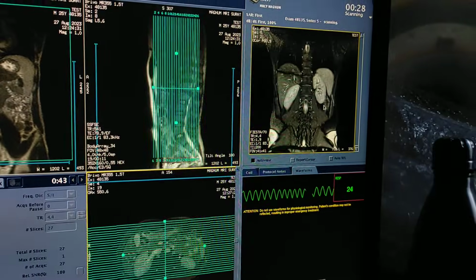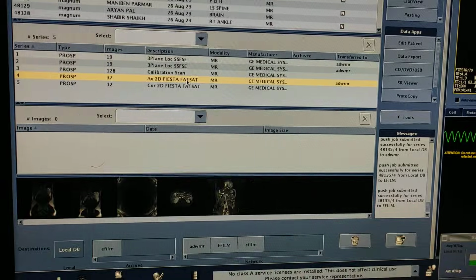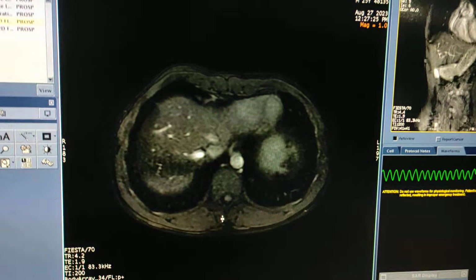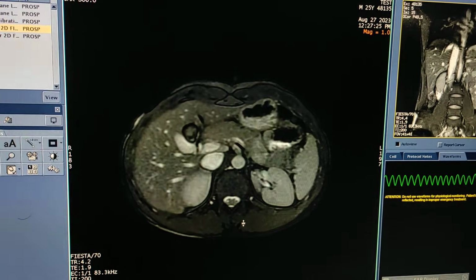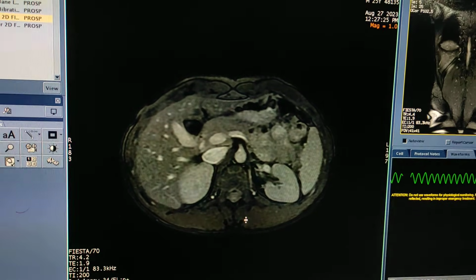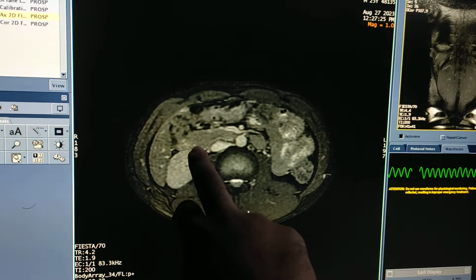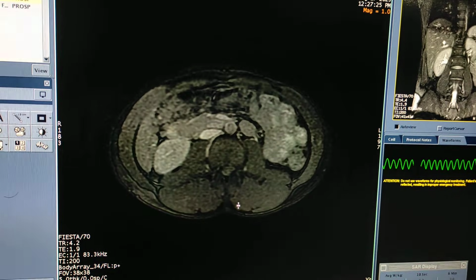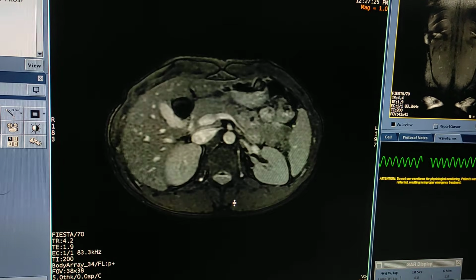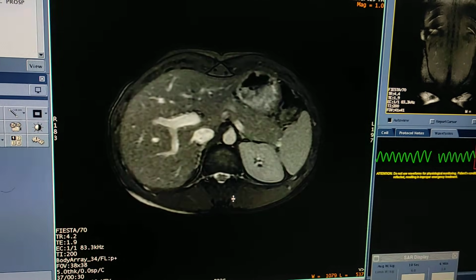So this is coronal. I will show you the anatomy over here in axials. Now see over here. So this is CBD over here. This is gallbladder. CBD is draining over here. Okay. So this much area you have to cover. Overnight fasting is very much necessary for a better resolution.